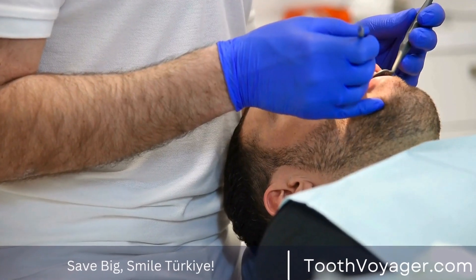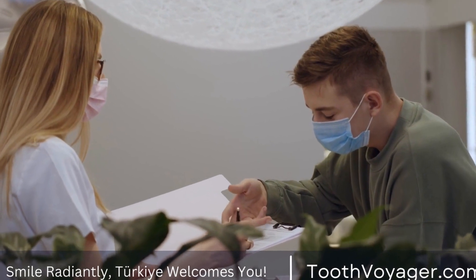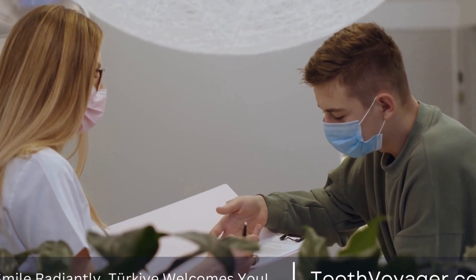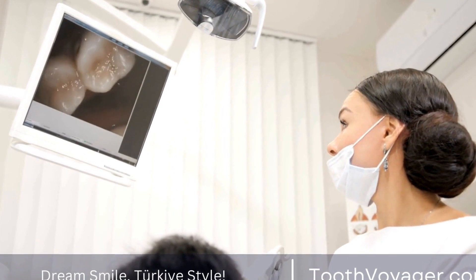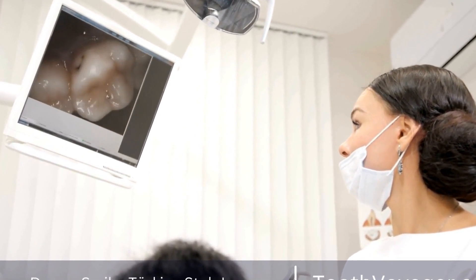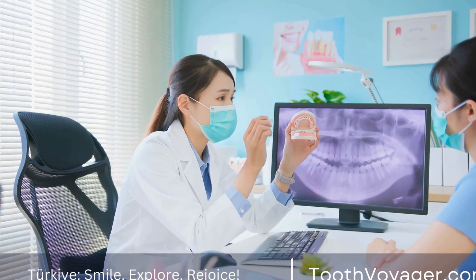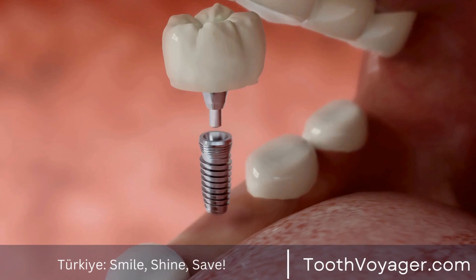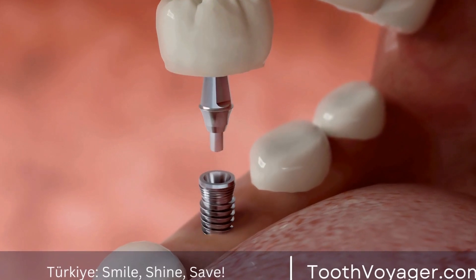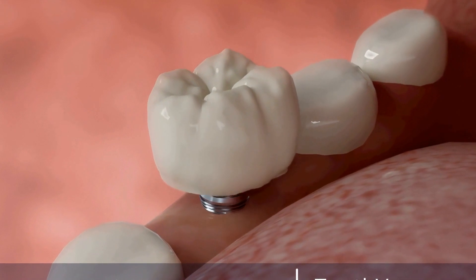The Installation Process. The first step in installing a dental bridge is to prepare the abutment teeth. This involves shaping the teeth to make room for the dental crowns, which will hold the bridge in place. Once the abutment teeth are prepared, impressions of the teeth are taken to ensure that the bridge fits properly. These impressions are sent to a dental laboratory, where the bridge is custom made to match the size, shape, and color of the surrounding teeth.